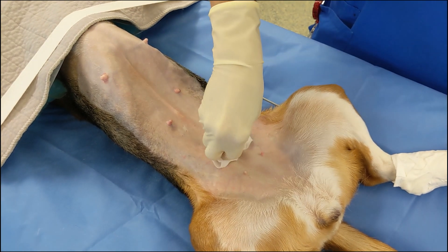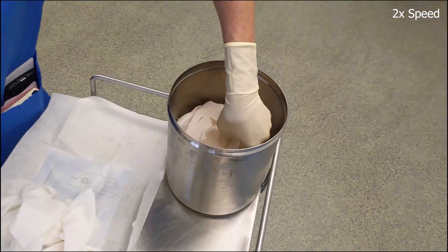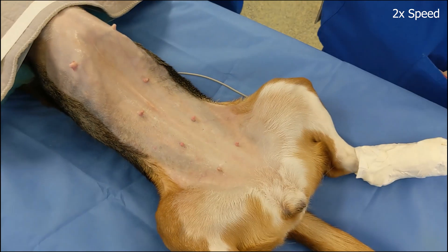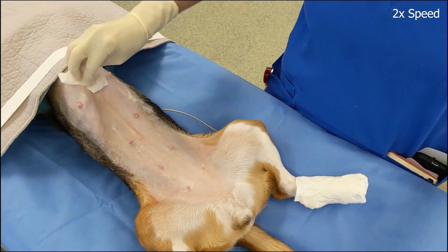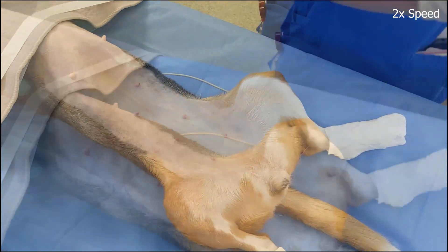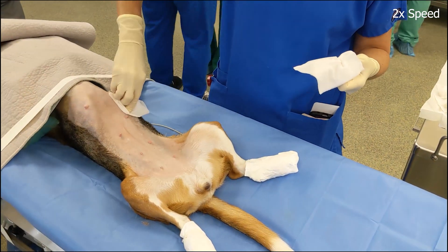All motions begin at the center of the surgical site and work their way out from there. This process is repeated, continuing with alternating rounds of chlorhexidine and alcohol scrubs. Two to three repetitions of chlorhexidine scrubs, contact time, and alcohol scrub are performed until a total of five minutes of chlorhexidine contact time has elapsed. The final scrub is always alcohol to remove chlorhexidine, which is irritating to the skin if left to dry.